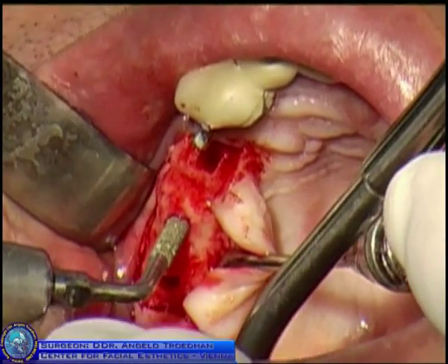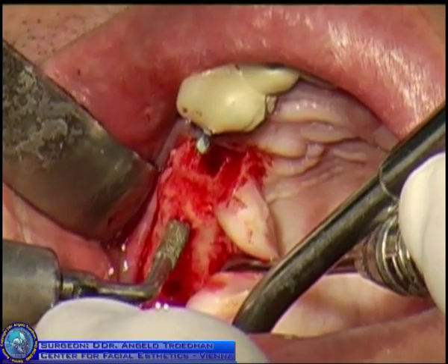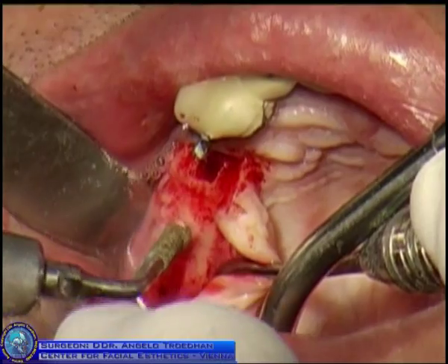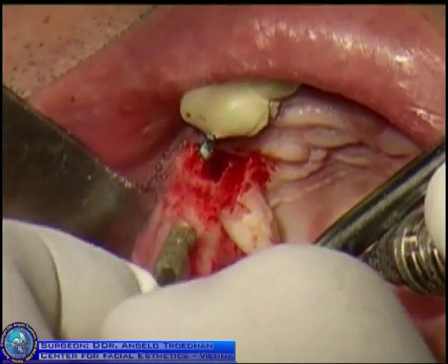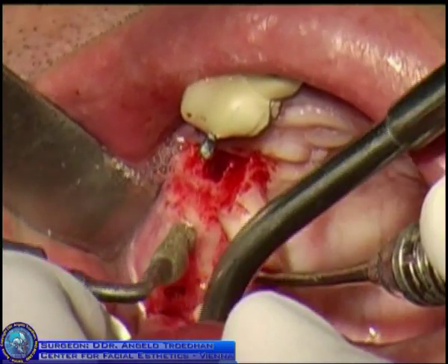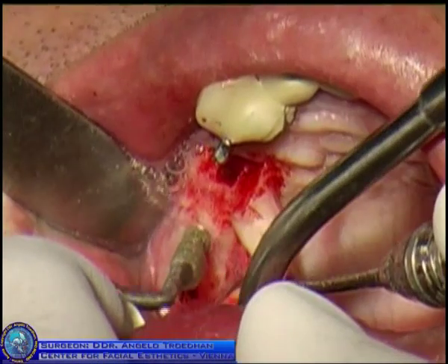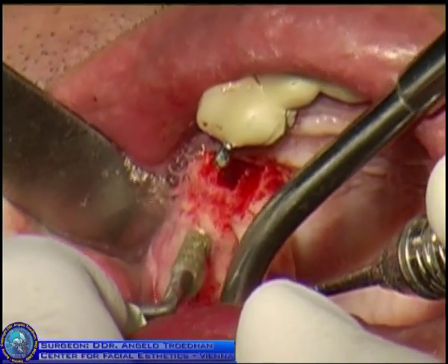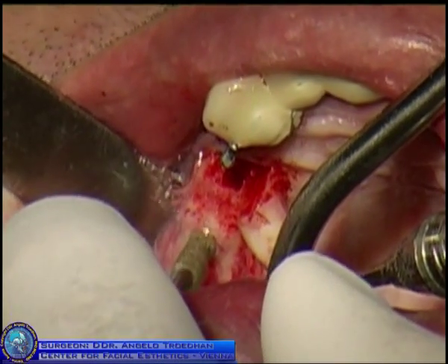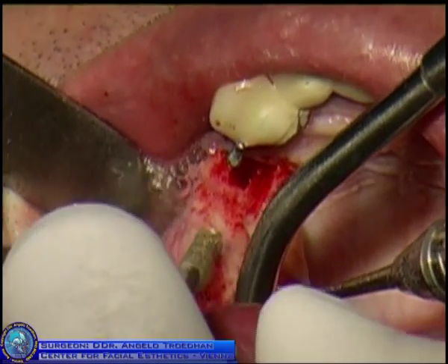Okay, so we finish now with TKW-4. And you see while it was very easy going with 1 to 3, the number 4 still takes time. You need to allow enough time with instrument 4.